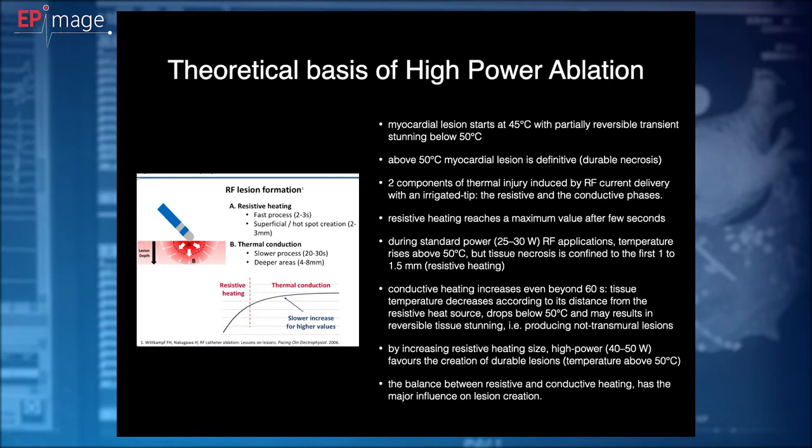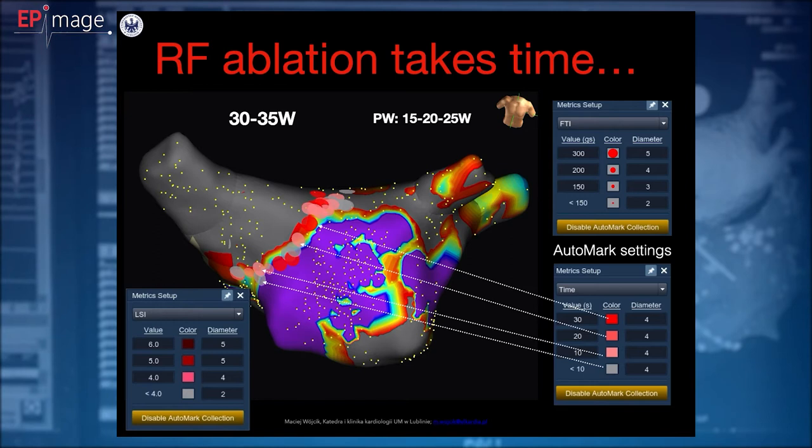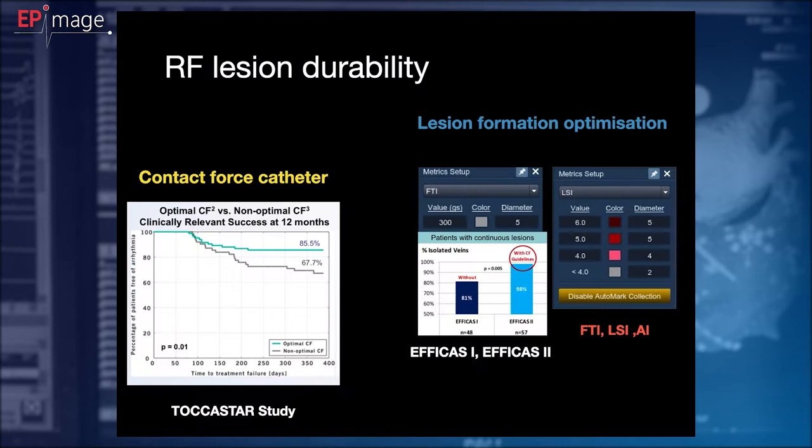With our standard approach, we use 30 watts during our ablation, and being on posterior wall, we use 15, 20, 25 watts depending on the operator. Most of us currently use contact force catheter, and we want to keep optimal contact force with our catheter to improve lesion durability.